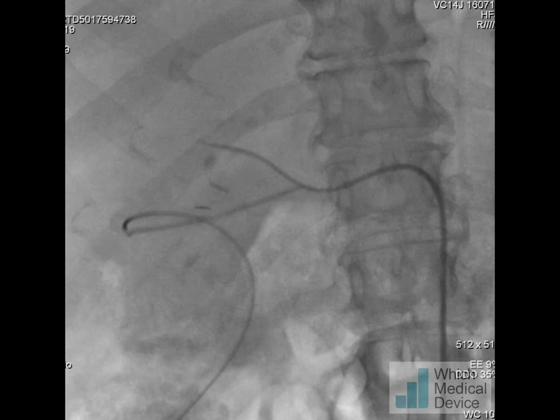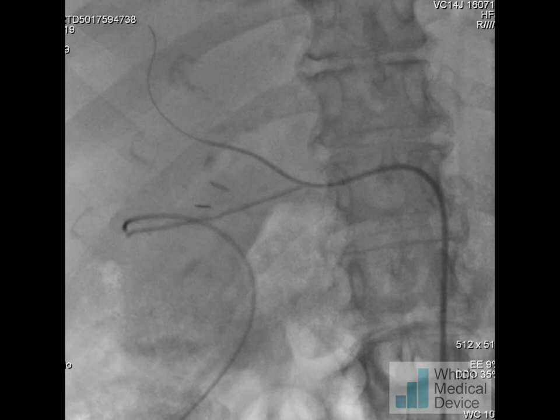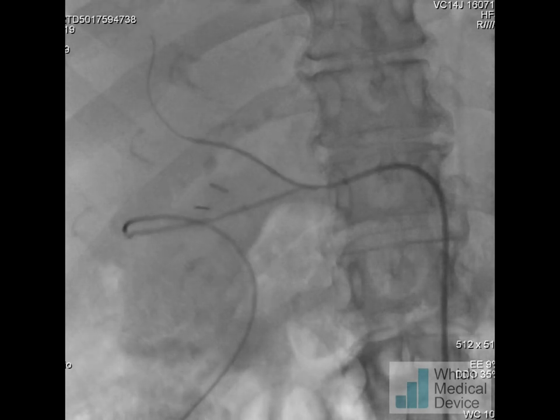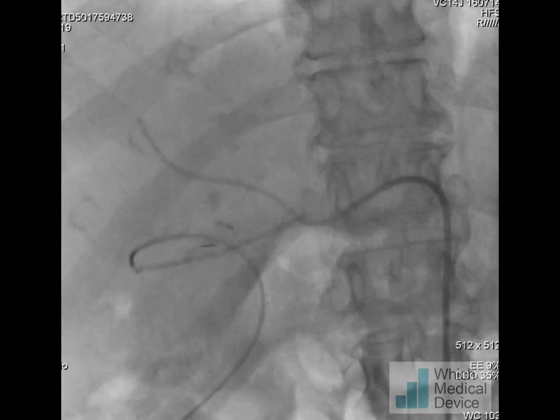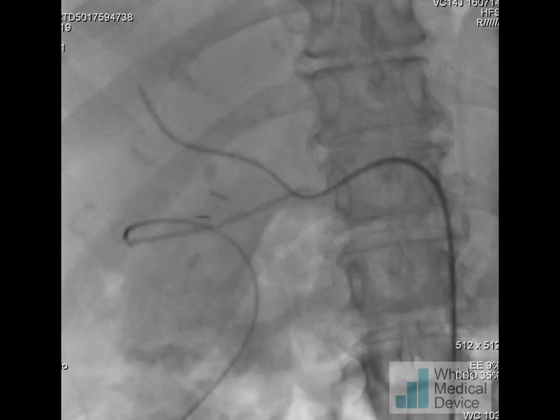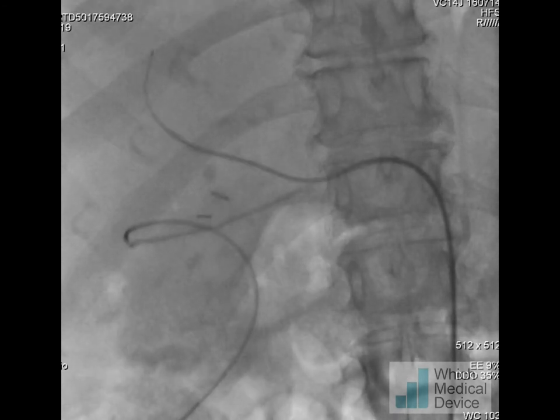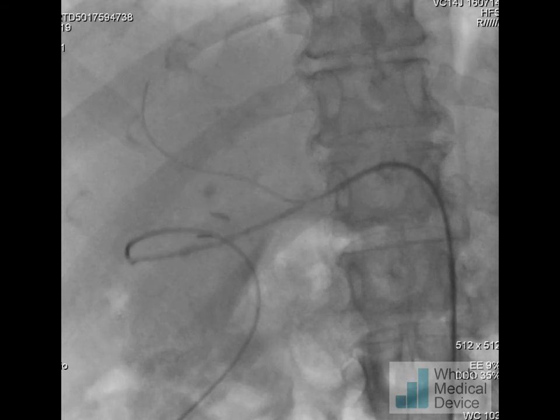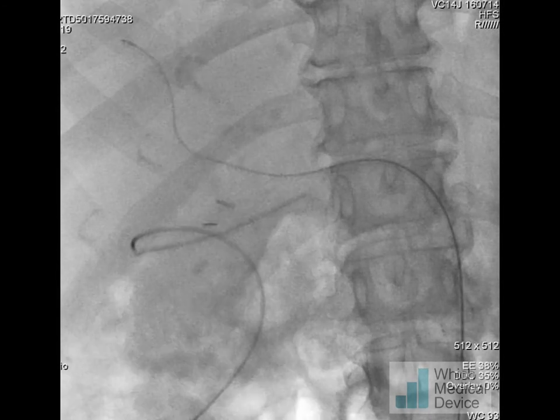Here I'm inserting an angled Glidewire which I can then steer and place very peripherally. I can advance my catheter and then insert through this catheter a 0.018 inch V18 guidewire, which although fine is very stiff and supportive for placement of a V12 balloon-expandable covered stent — this is over a 0.018 system of course.